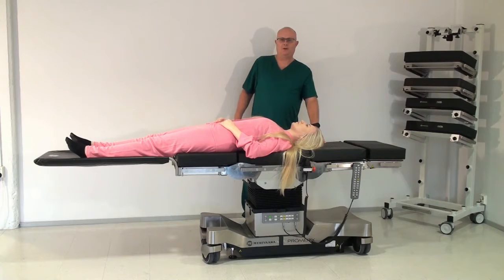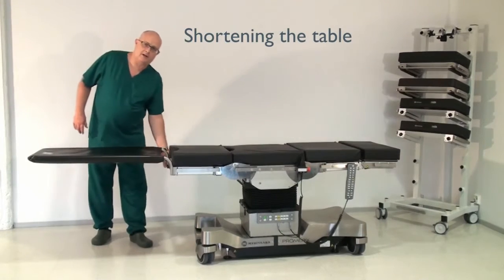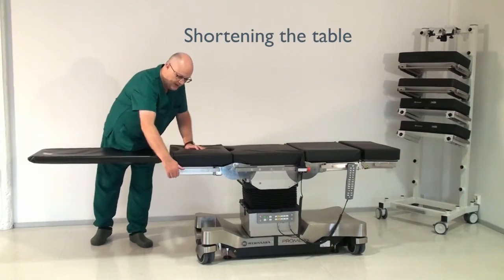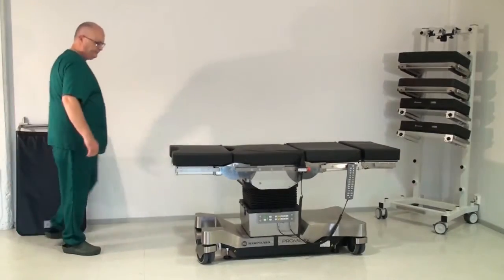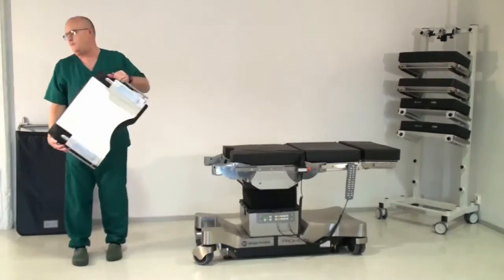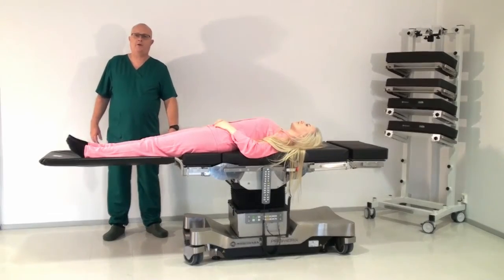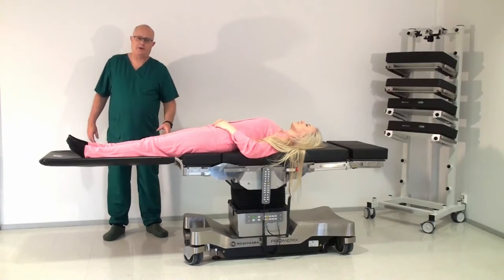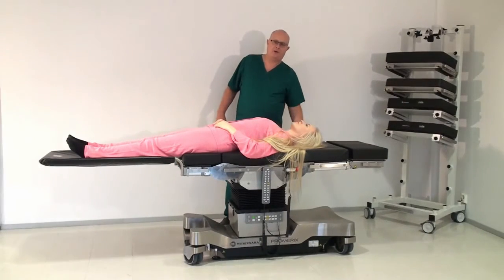Okay, so I'm just going to show you the ways that we deal with that. Talking about some options to shorten the table. If I take the lightweight leg section out and I remove the 40 section from the table, we also have the option of a short 25 section. At the moment I put one short pelvic section into the table. So now the table is shorter, but if you look at the position that our model is in, the head is still nowhere near the head section.